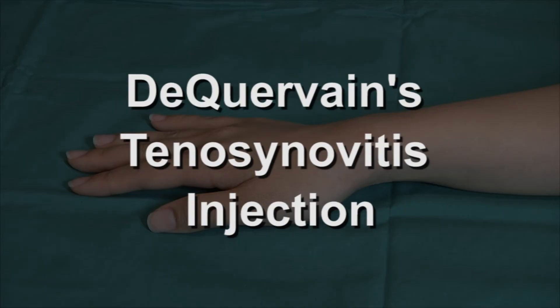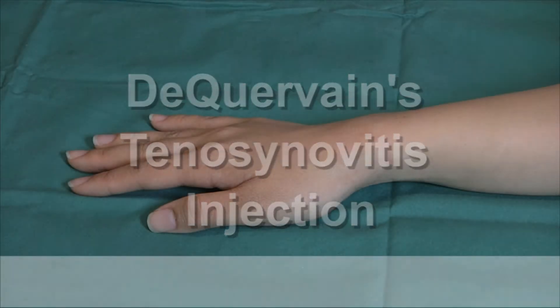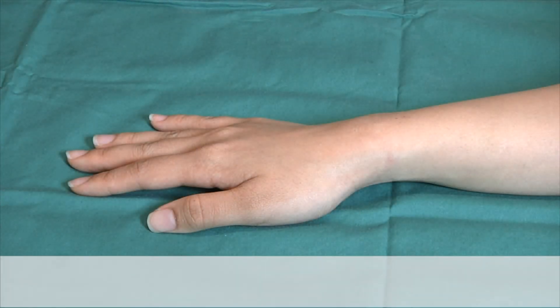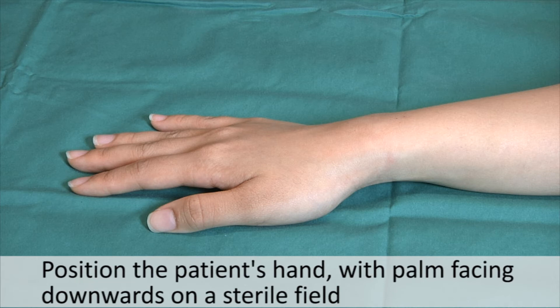Today, we are going to do an injection for de Quervain's tenosynovitis. First, position the patient's hand with palm facing downwards in a sterile field.